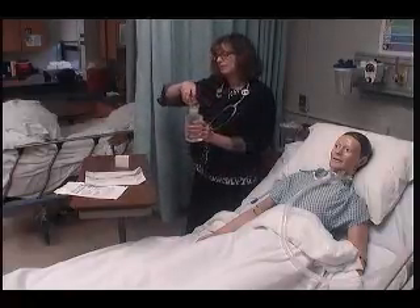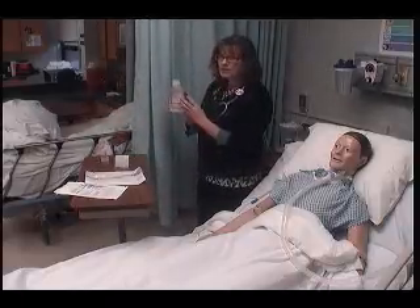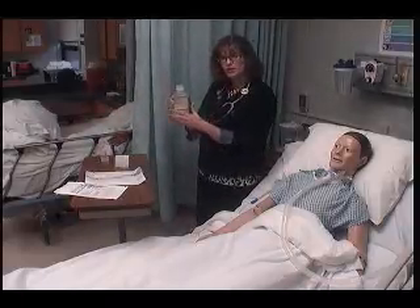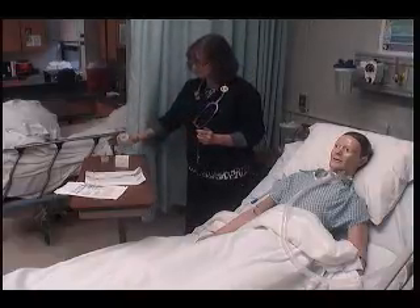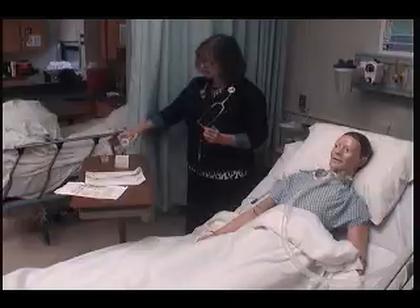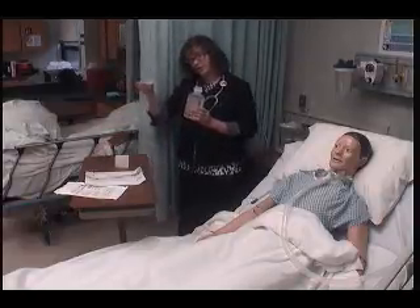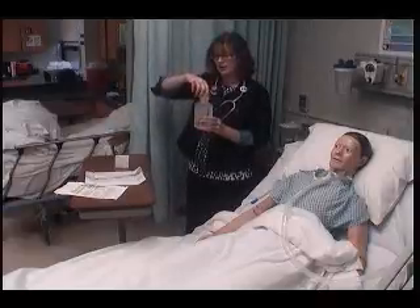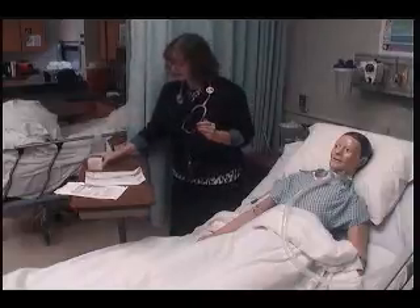I take my sterile saline, take the lid off, and put the lid down properly. If this was not brand new, I would lip it first, but since it's brand new I can just pour it into my suction container. Be careful how you pick this up. Put the lid back on top. Date, time, and initial that. I'm going to put this over to the side.